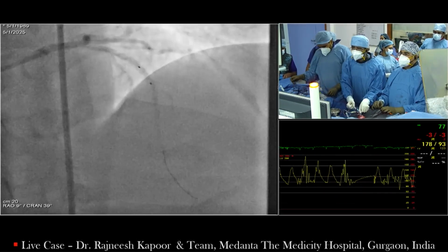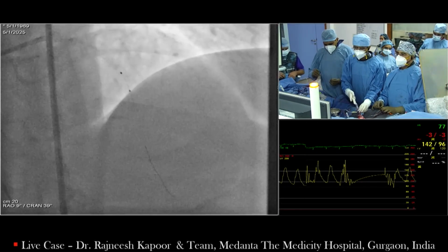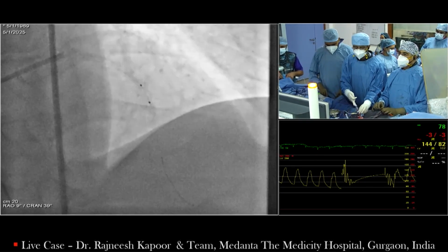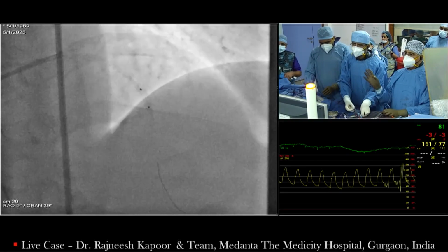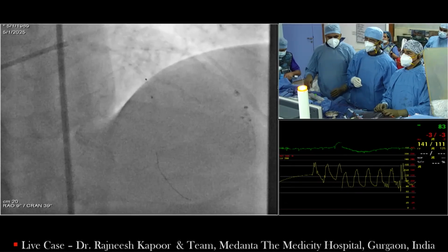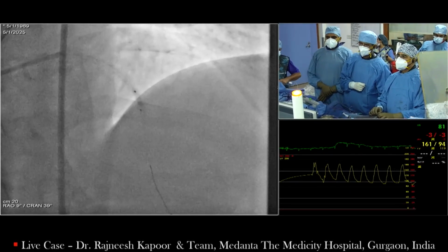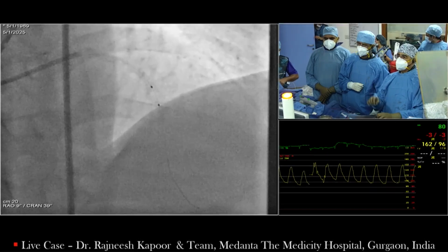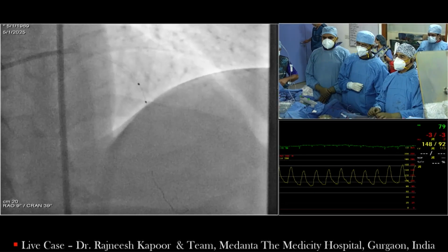So I understand the discussion was rota for a non-crossable lesion, and our policy is also rota. But here we were prepared with orbital, so we thought let's do that, and in the meantime we were actually preparing rota also. Go up, 6, 8, 10, down. See, this is the tightest point, and it's actually opening up well.